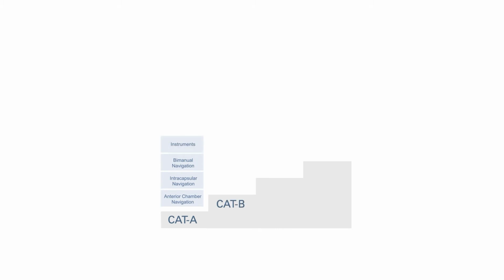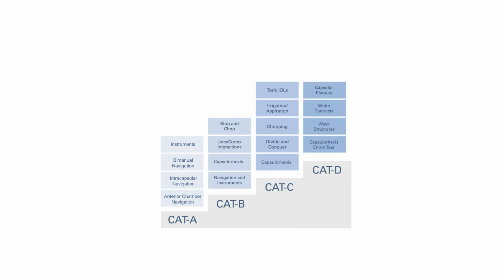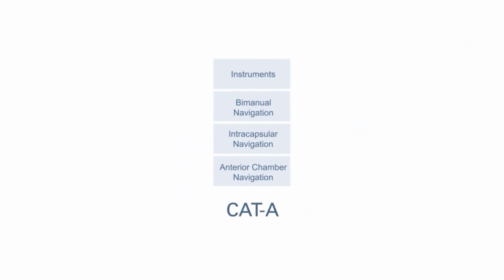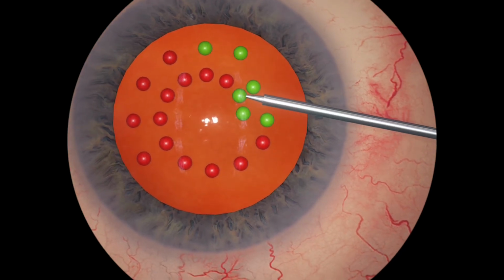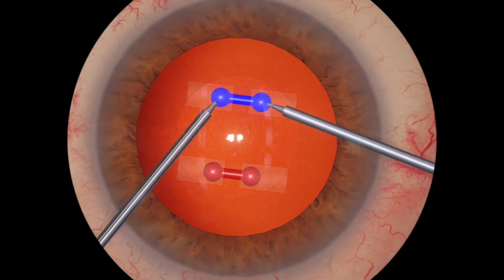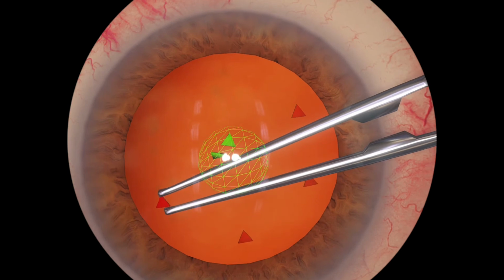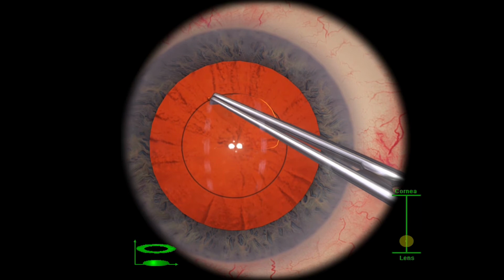All IC simulators feature an embedded curriculum. The courses are organized in tiers with ascending levels of difficulty. For example, first-year residents start their cataract training with tier Cat A of the cataract courseware. By means of abstract scenarios, residents learn basic microsurgical skills and proper use of microscope and OR machine settings. As they proceed, tasks get more and more demanding. Tier B introduces basic steps of the capsulorhexis.